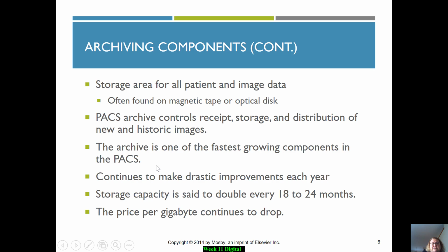There are a lot of facilities that are keepers of PACS now, so you'll see a lot of companies that have archiving systems to store these images for hospitals that are off-site. So we're seeing a lot of growth taking place, especially when you're looking at a family doctor's office that's not part of the hospital system. Let's say they're a foot doctor or they're a med center, like Hope Urgent Care here in town. They're not part of a hospital system, but they still want to archive their PACS images.